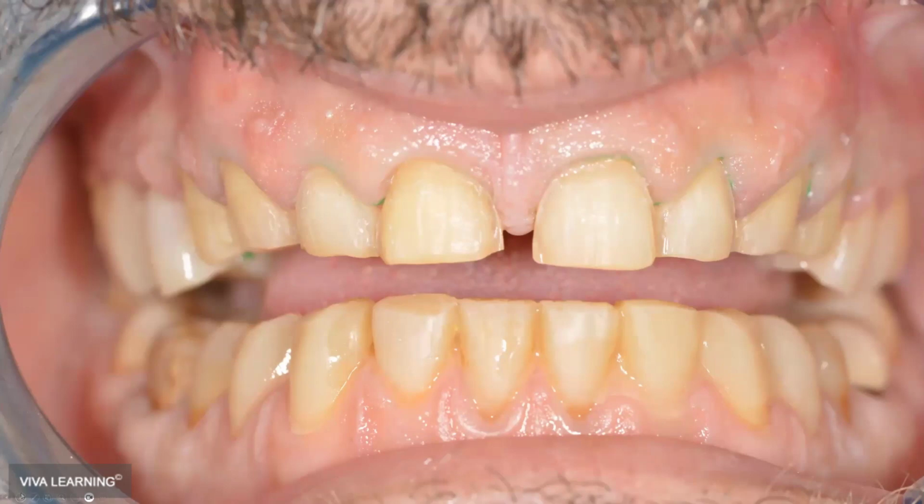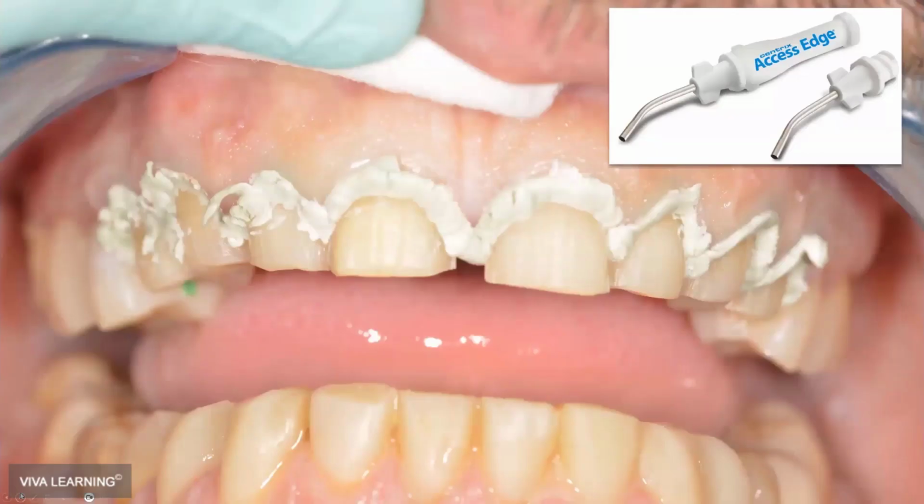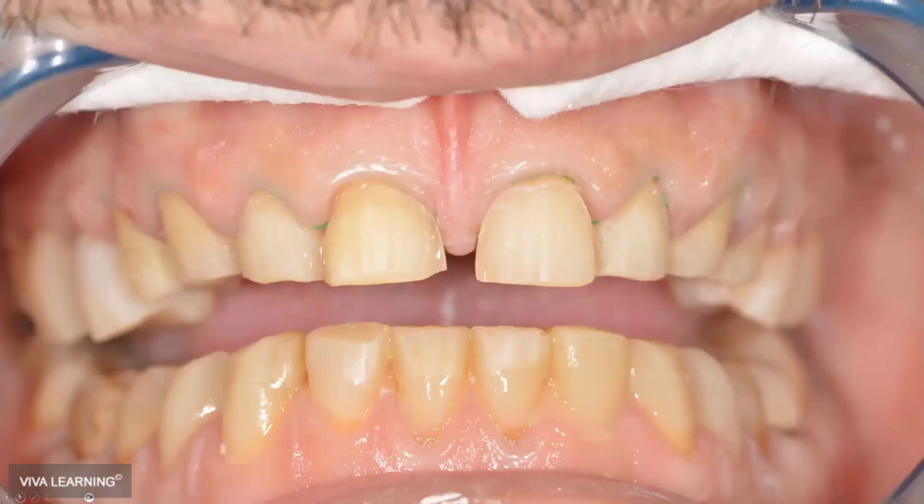The plan for this patient is to leave the margin supragingivally. I don't want to go under the tissue with the restorations. With the cord in place, we inject the retraction material, leave it for 2 minutes. And you can clearly see also in the picture that we have a lot of retraction.